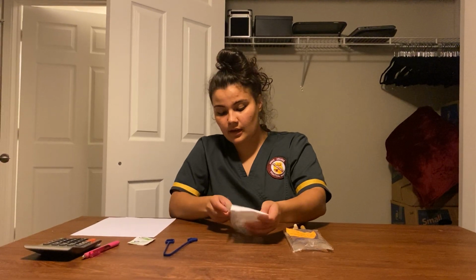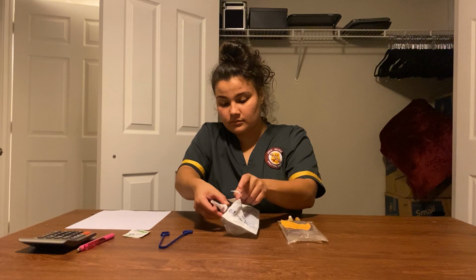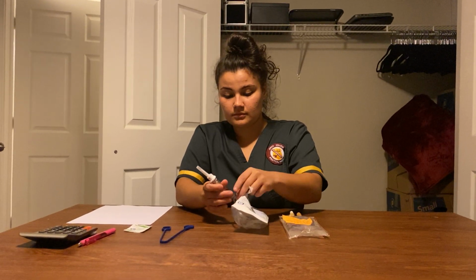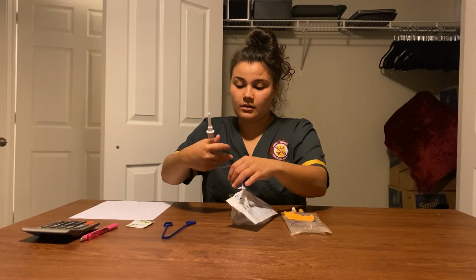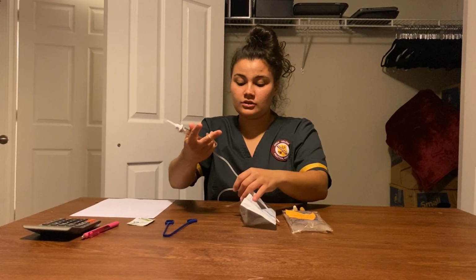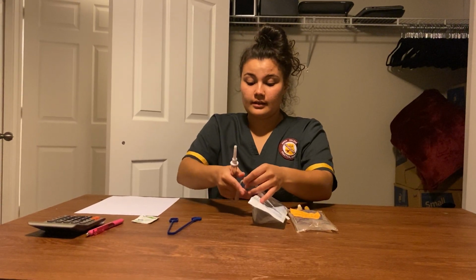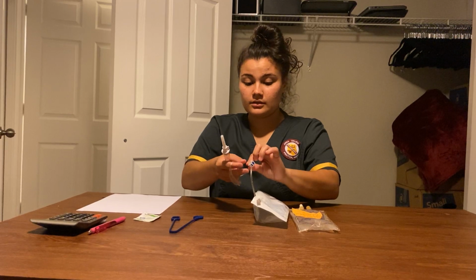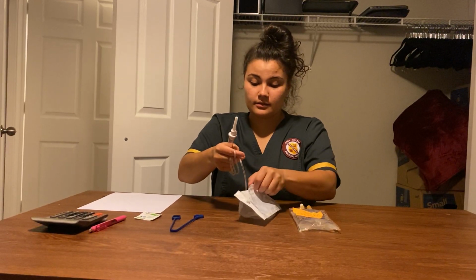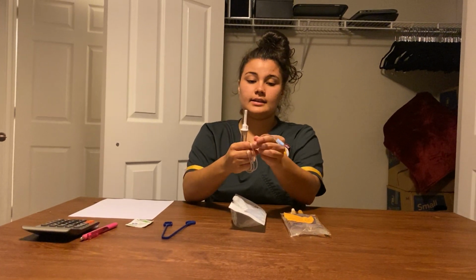So let's get this out. I'm going to wrap it around my hand, making sure not to touch that top part. And I'm going to take this out just like this. So I'm going to have it like this.